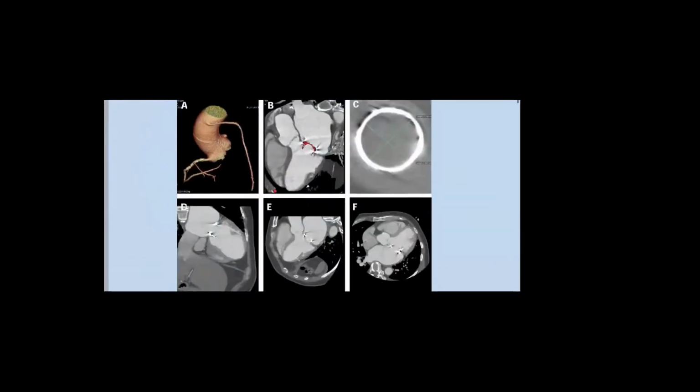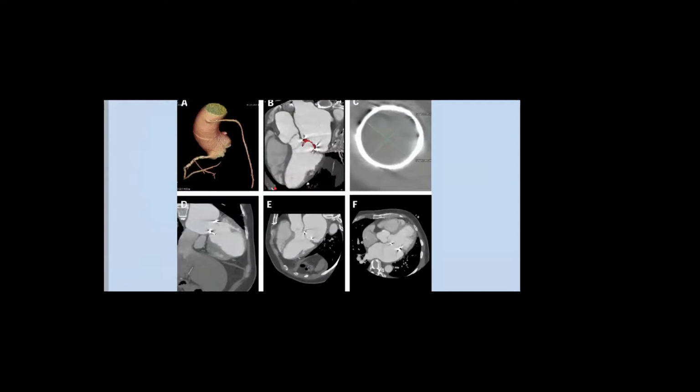Again, there is valve-in-valve implantation, another interventional procedure done for degenerative bioprosthesis. You can put a valve in the degenerative valve. You also have to use CT for assessment of the size of the bioprosthesis, and they can even do a simulation where they put the new valve and you see how this new valve is going to affect the LVOT.